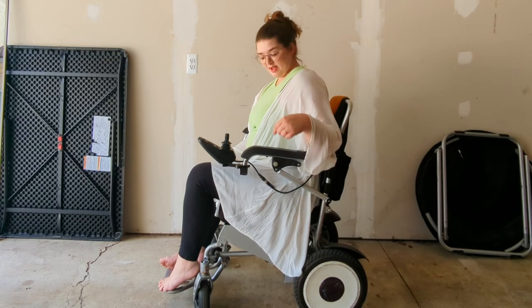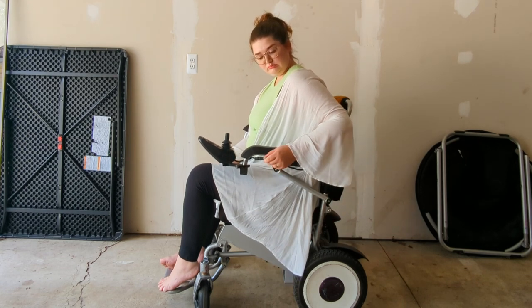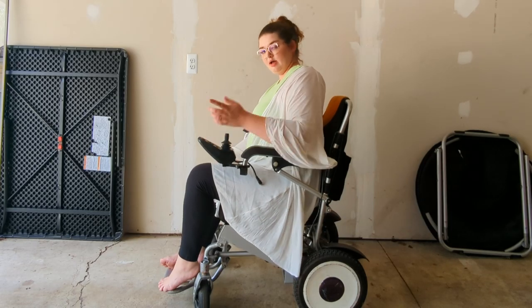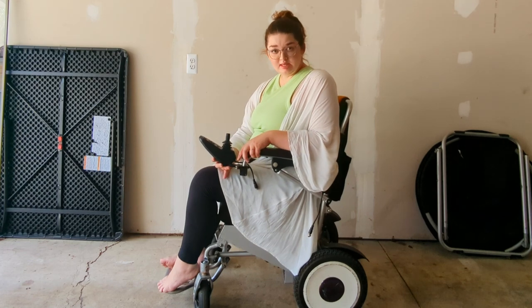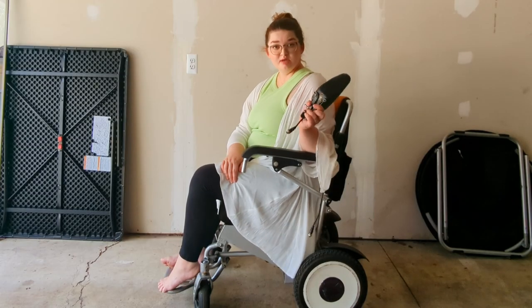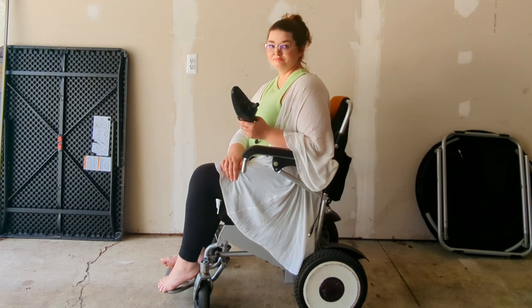The controller is powered by this cord here, which goes down to the computer and the battery. To disconnect, it has this little screw fitting here — disconnect it, and it doesn't go anywhere. So when I go on an airplane and my wheelchair needs to be stowed beneath the plane, I always take the controller off and take it with me on the plane. 29 wheelchairs a day are broken or damaged by airlines.